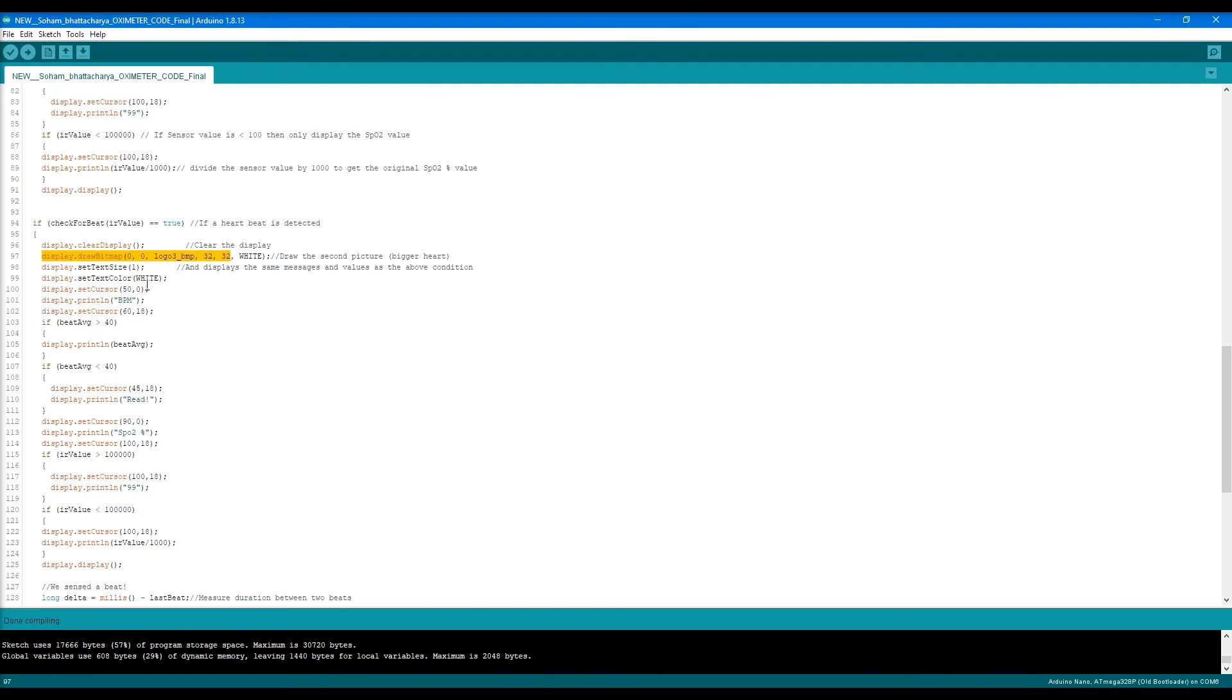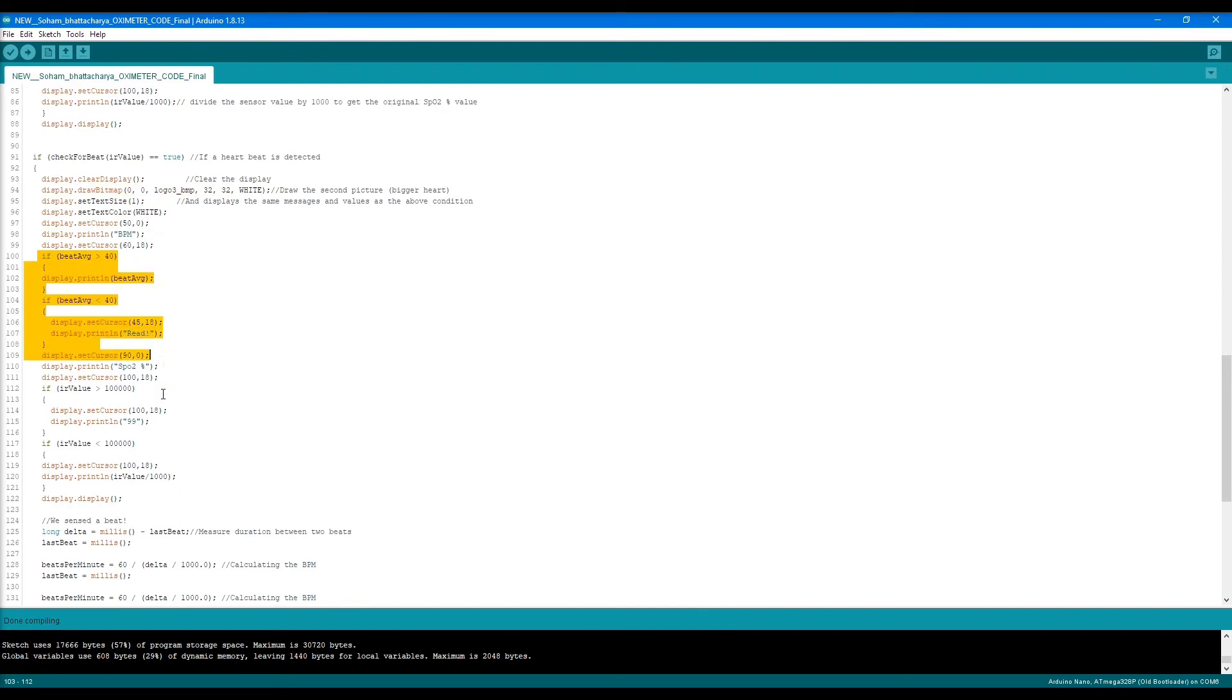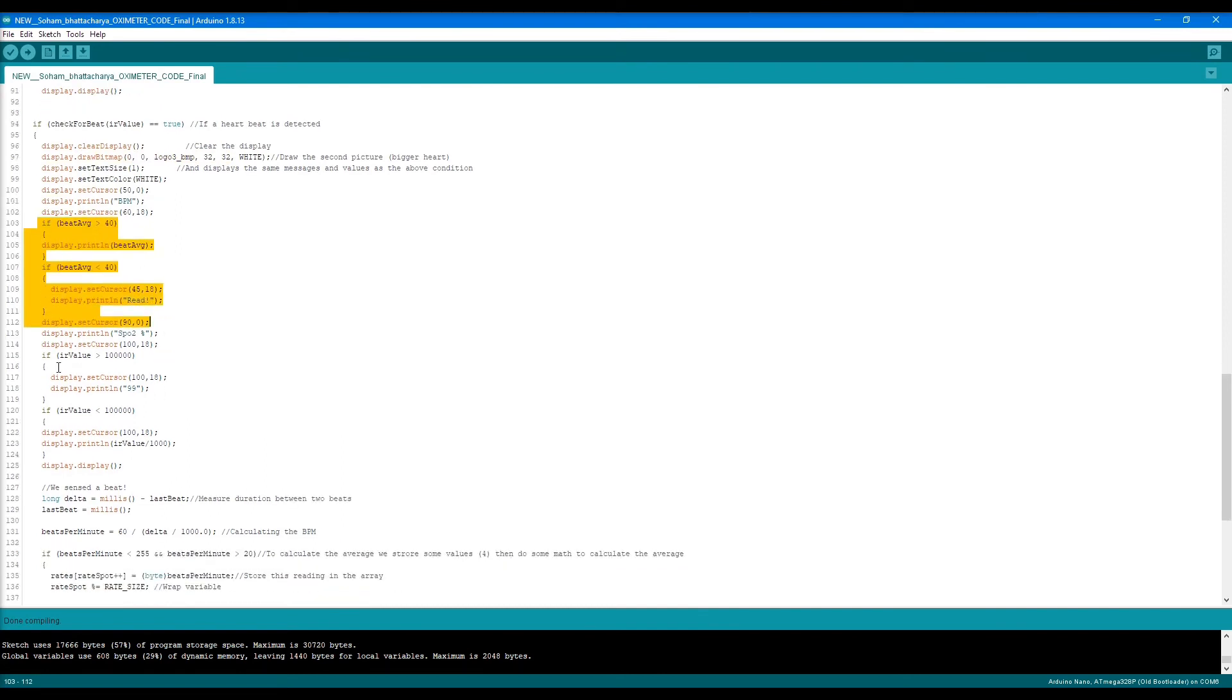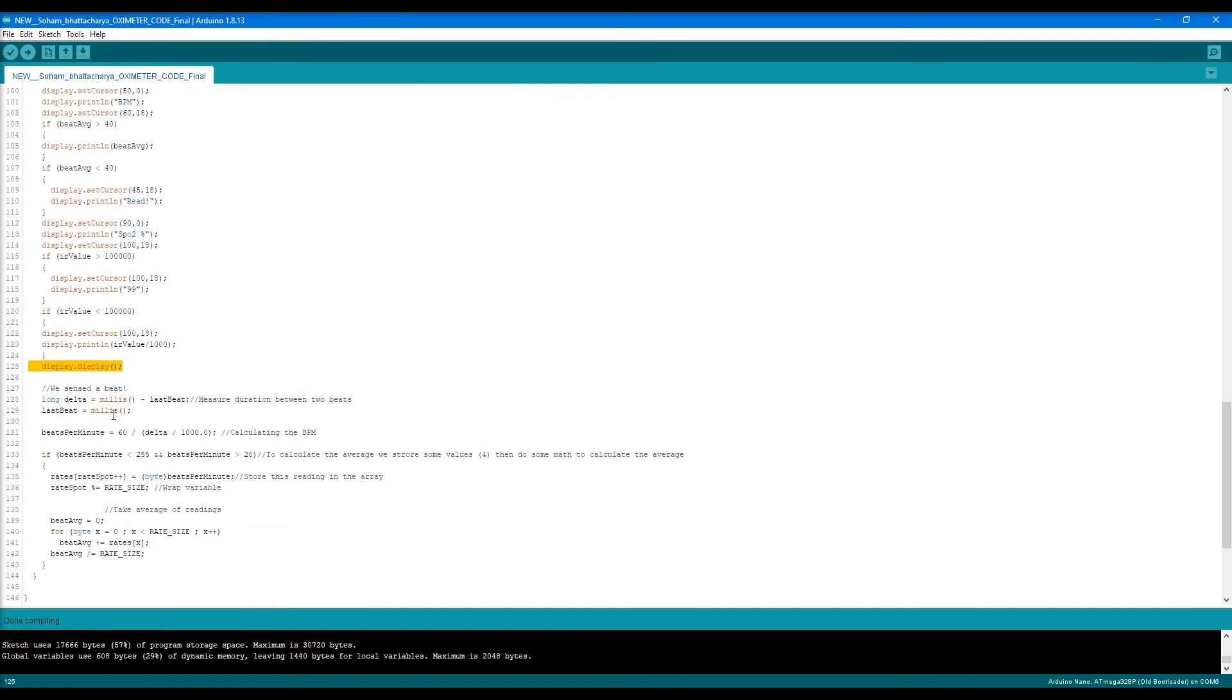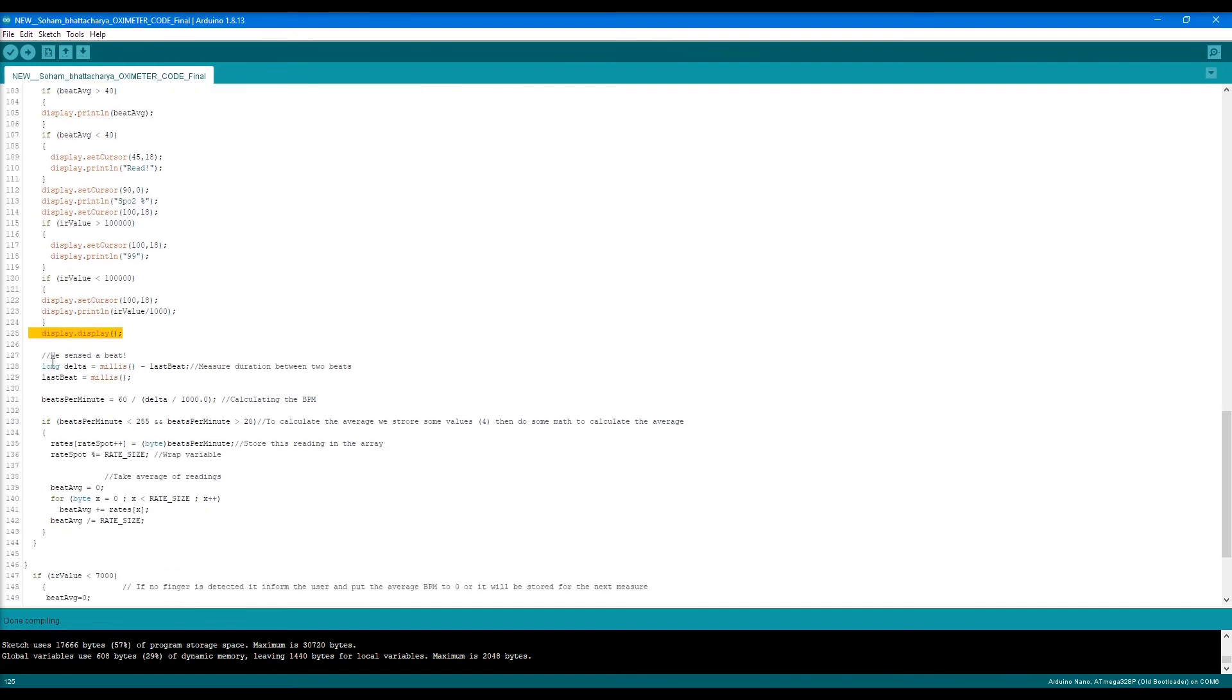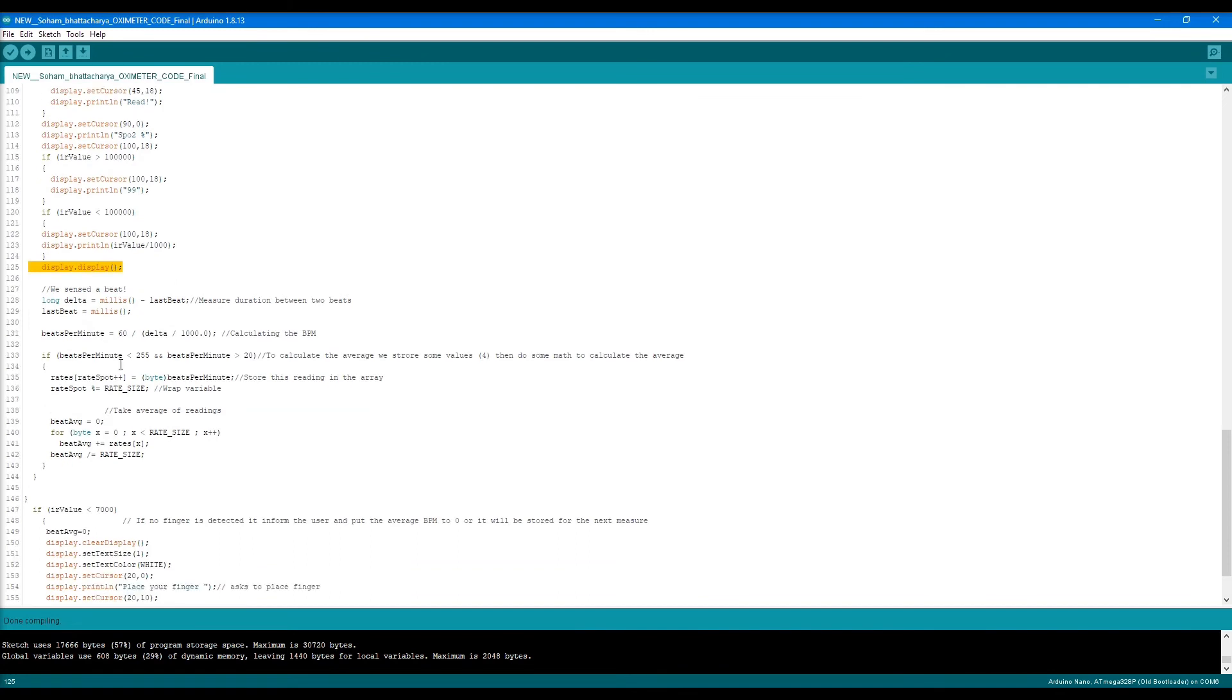Again, set the text, color, and size. Set the cursor, BPM. The same if condition is run again, and this goes on up to line 125. Then within the variable delta, we measure the duration between two heartbeats, and we calculate the BPM with this line.